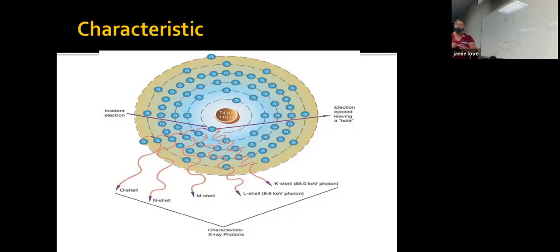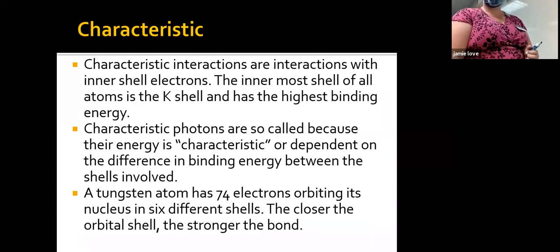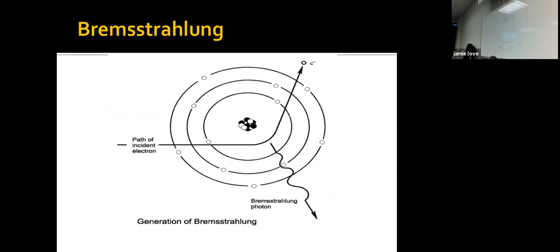All right, so Bremsstrahlung means breaking radiation. Let me scroll back to Brems. Yep, the other page is Bremsstrahlung, right next door. You said breaking radiation? Yep. So Bremsstrahlung is like you're walking by and you see a really cute guy or a girl and you stop and turn and look.